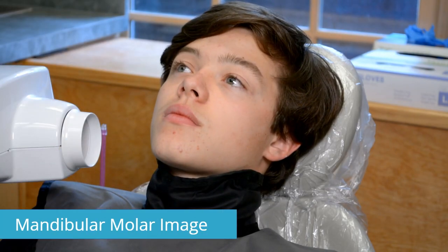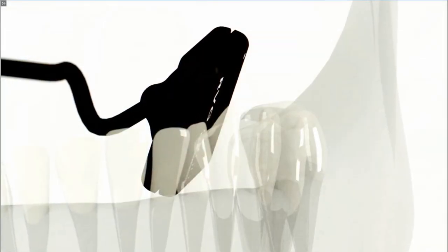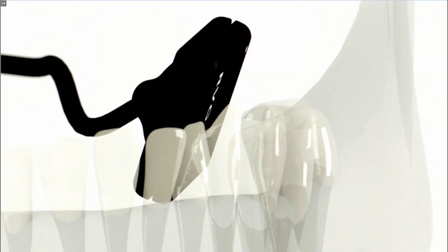Gently align the generator tube with the positioning device and move into position to acquire the image. Mandibular molar image. To acquire a mandibular molar image, insert the sensor into the patient's mouth in a horizontal position so that the sensor is parallel to the floor.